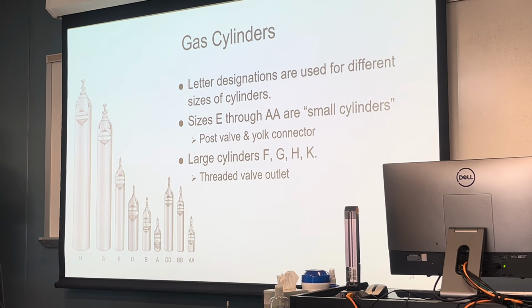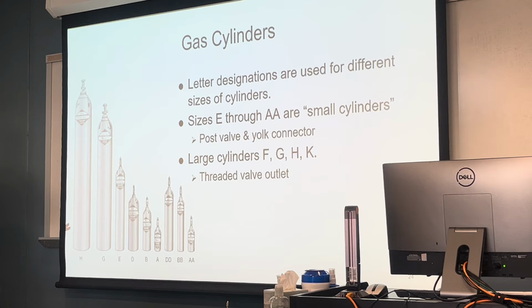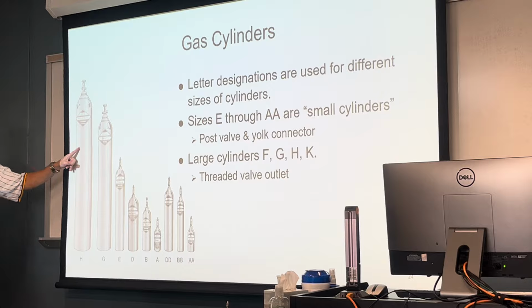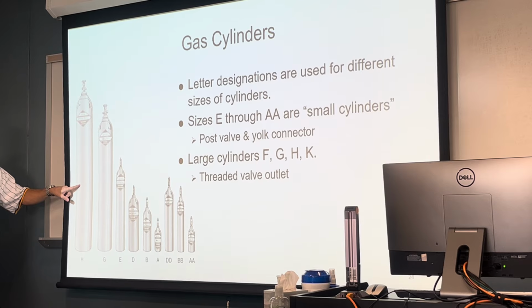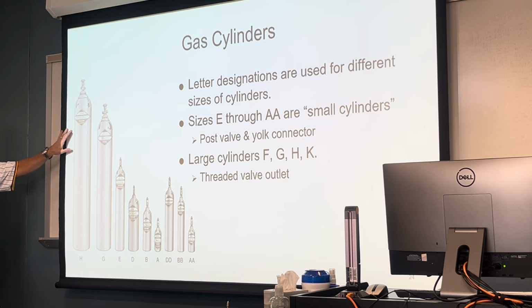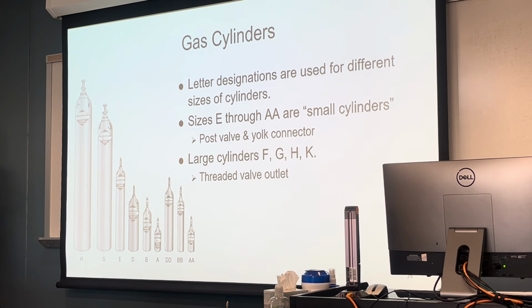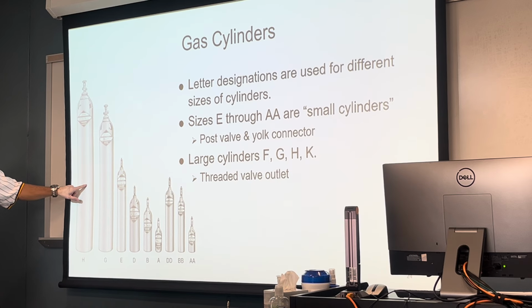But here's an example. Our hospital is going through some repair of the piped-in oxygen system, and this whole ICU is going to be without piped-in oxygen for the next 6 to 8 hours as facilities works on that line. What can we bring in for all of our patients? We can bring in these big tanks and leave them in the room. This helps run my ventilator, and I know it's going to last a good long time, giving the facilities folks time to make the necessary repairs to the piped-in wall system. So you will see these in use from time to time.